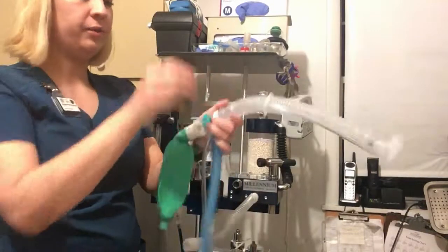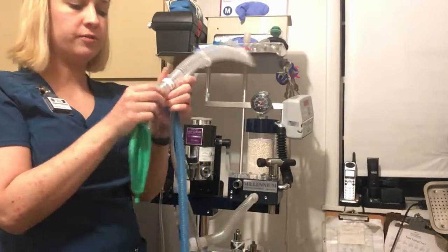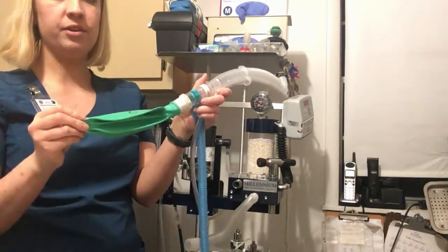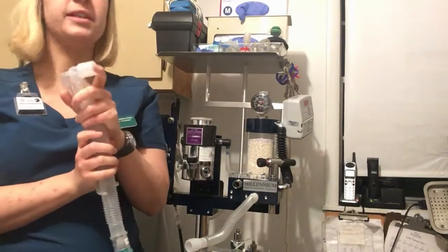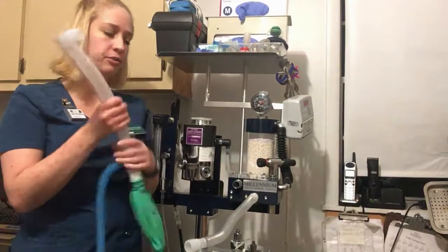Over here you will have your open and close valve, and then you'll have your reservoir bag attached at the end, and this part will be attached to the endotracheal tube.